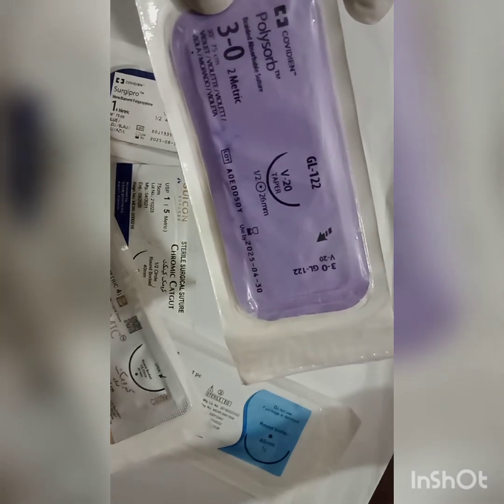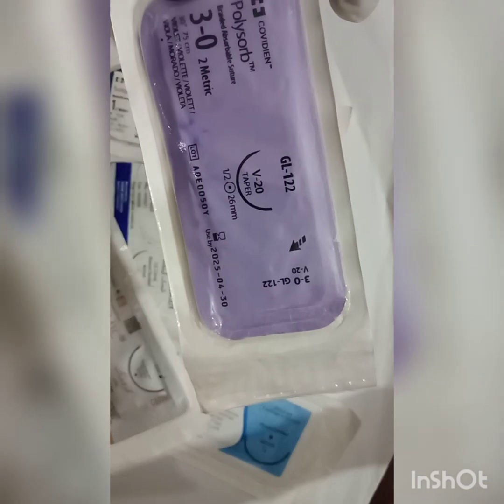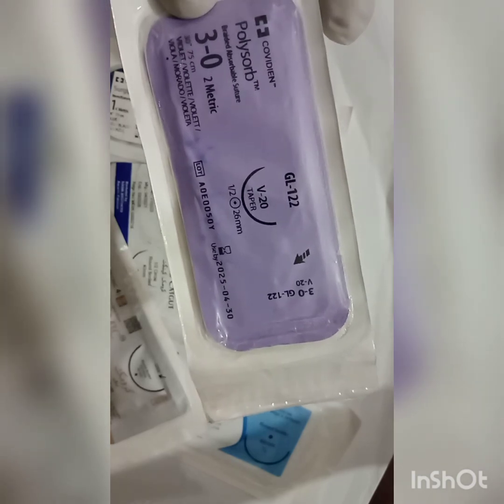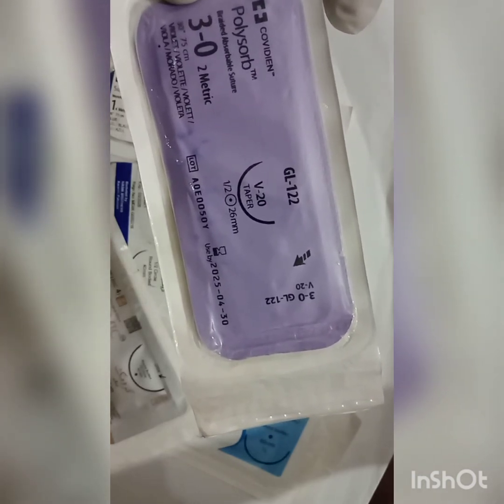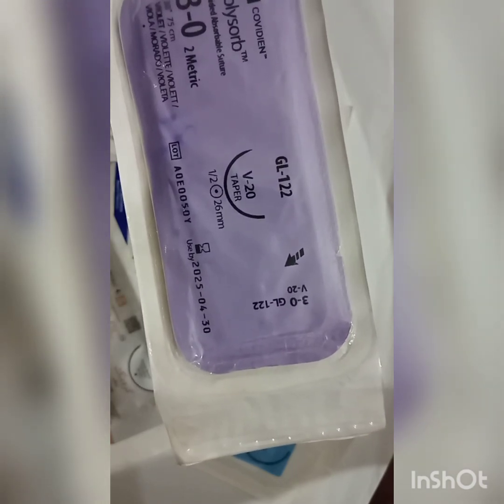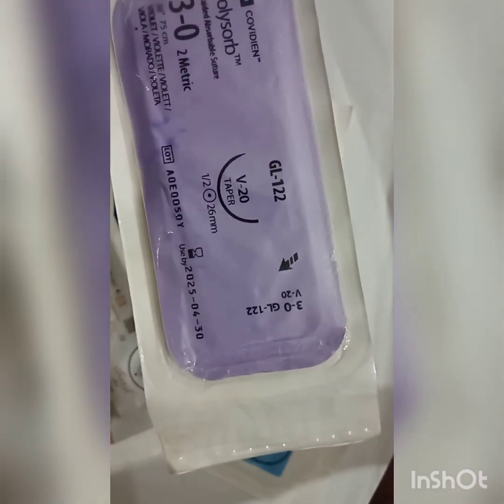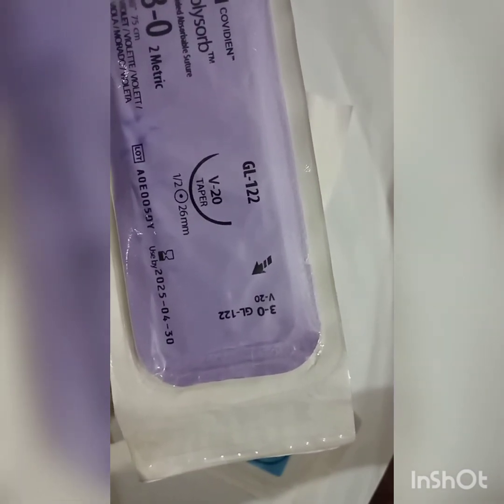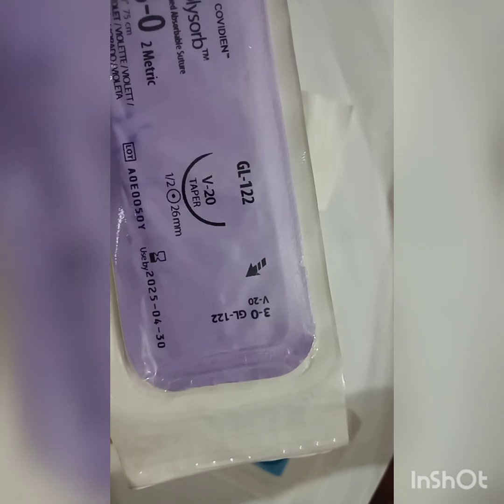Actually, the diameter or size of the suture material is taken in two systems. One is USP, the United States Pharmacopoeia system, and the other is the metric system. In USP, the suture material is taken as 3-0, 2-0, 4-0 for the smaller ones, and for the bigger ones 0, 1, 2, 3. Why is it so? Actually, initially in the United States, when sutures were formed, they were taken in the gauge as 0, 1, 2. With increasing number, the diameter of the suture was increasing.